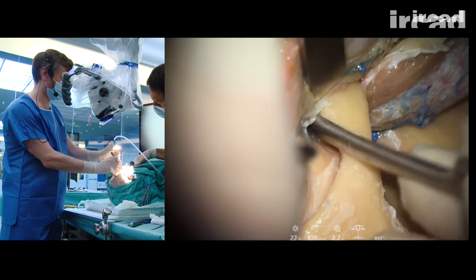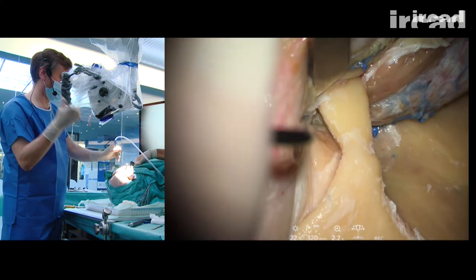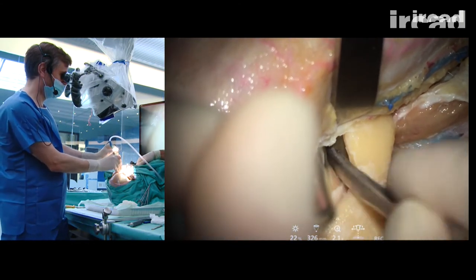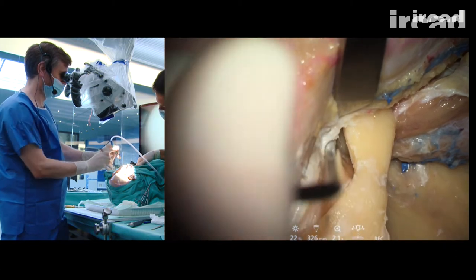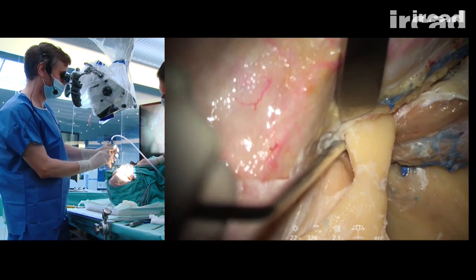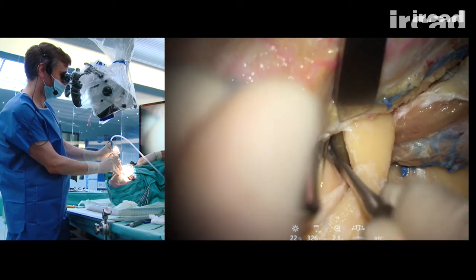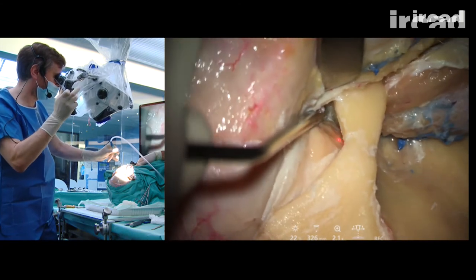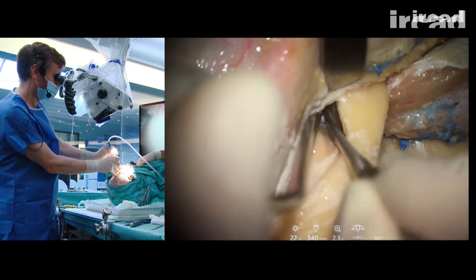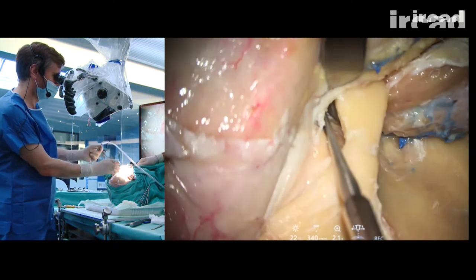And progressively, I move along the lateral wall of the orbit towards the lateral aspect of the inferior orbital fissure. A smaller dissector is necessary here until I feel the defect of the inferior orbital fissure. Here, I just felt the defect.